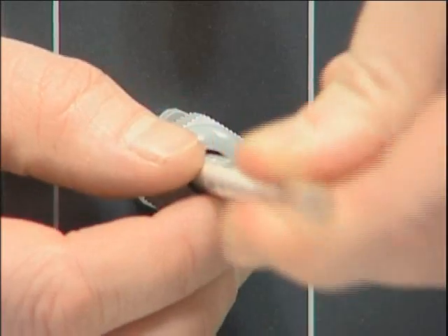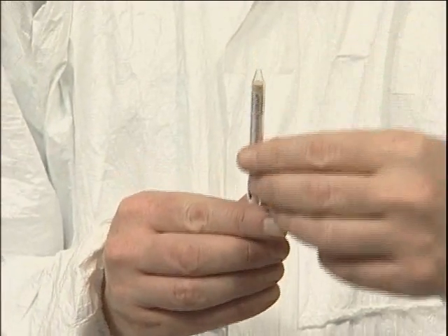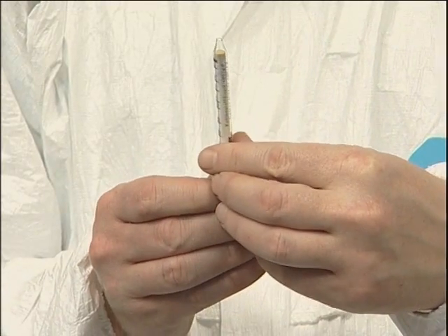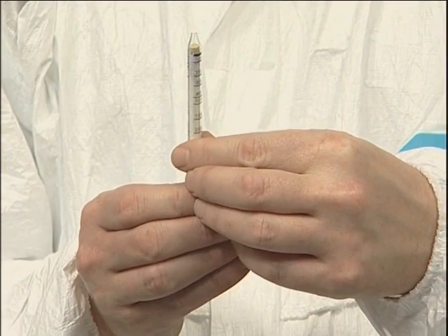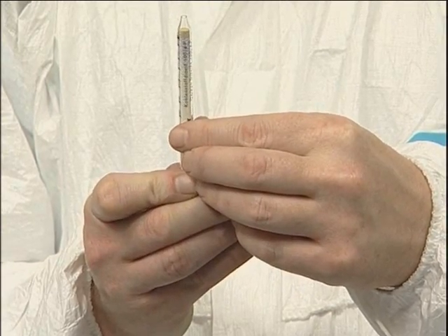A maximum carbon dioxide level of 500 parts per million is permissible in breathing air. The expected background level is approximately 380 parts per million and this will be represented as a purple stain at the start of the CO2 tube.